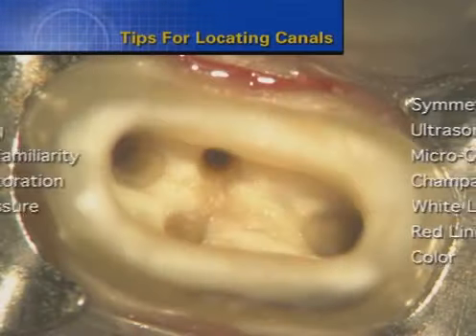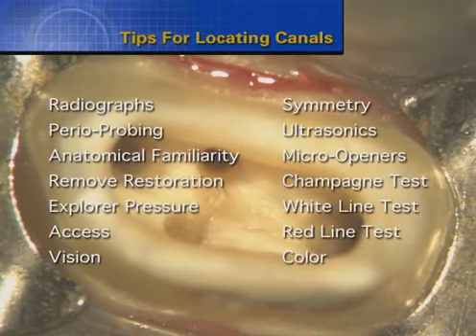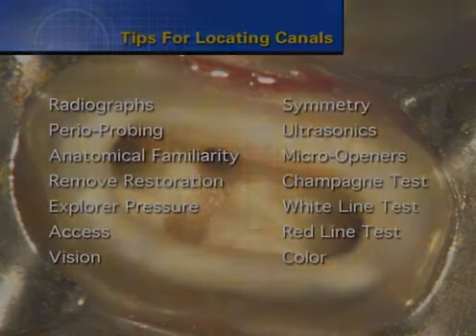There are a number of strategies that, when used in combination, greatly increase the identification of additional systems. The more useful techniques are summarized here, and the clinician should keep in mind that at times, certain treatment modalities are more appropriate for a particular tooth.